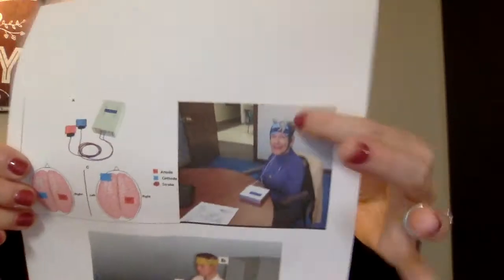So on your client, you're going to want to make sure you clear any dirt, oil, lotion, makeup, anything that's on their skin before putting the electrode on there. And again, make sure the electrodes are soaked in saline solution. You're going to want to make sure that these electrodes are pressed firmly onto the skin, and the positioning headband can help keep them there securely as well. So that's what that woman has on her head right there, a securing headband.